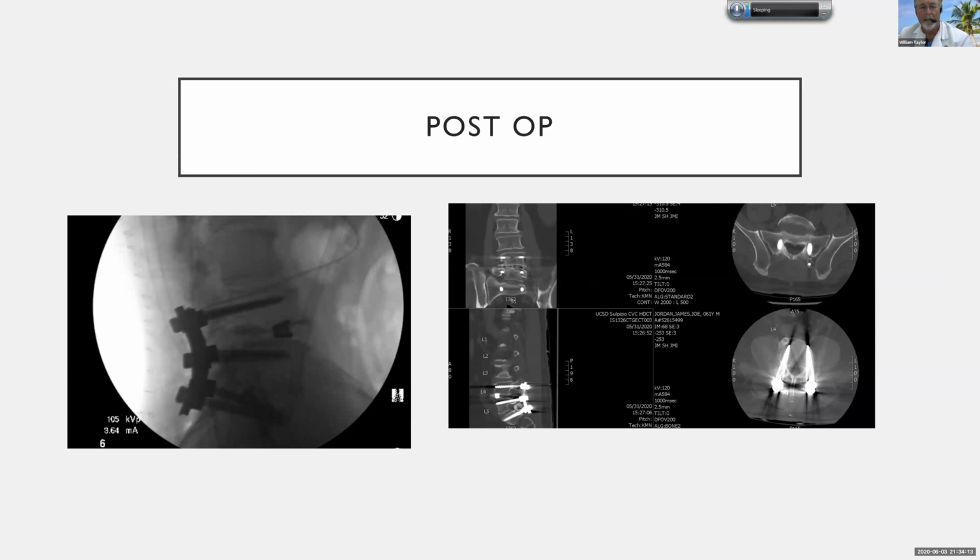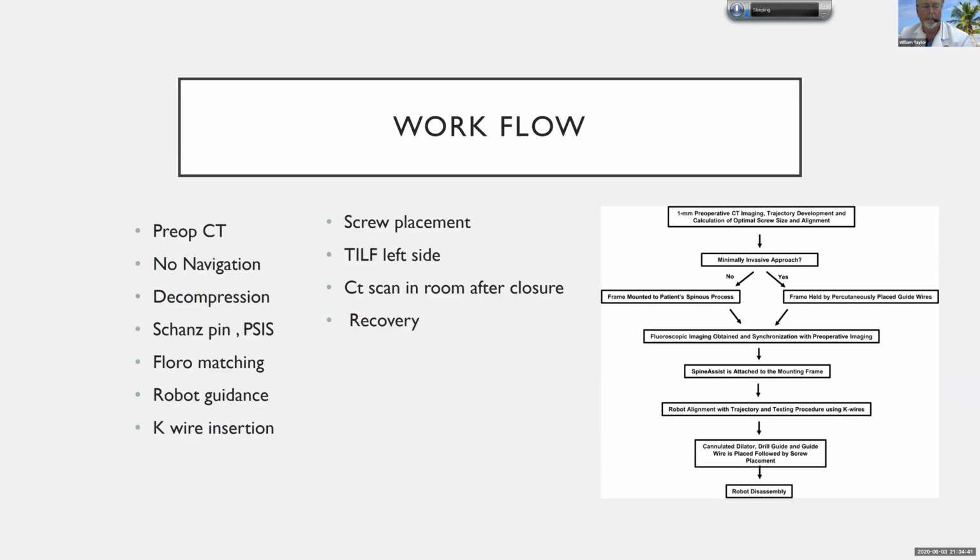What you get, especially with the CT scan post-op, you can see down here, you can absolutely place the S1 screws just so they're just barely transcortical. You can get long screws perfectly placed in exactly the right location. And I think you can see on the bottom right, we're just right up against the cortex and the placement of the S1 screws, and you really get that very, very well with this.